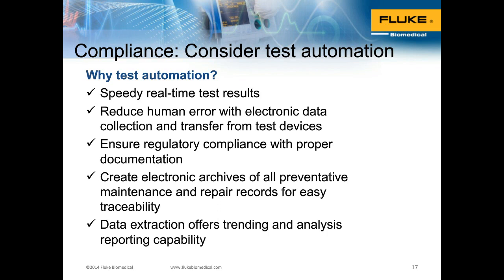So when you automate a preventative maintenance procedure, and let's say there is a software program that is guiding you through every single step that is required from start to finish on preventive maintenance on your infusion pump, you are ensuring that no matter who does the preventative maintenance on that pump, the same work is going to be done every single time in the order, and the data will be archived as specified.